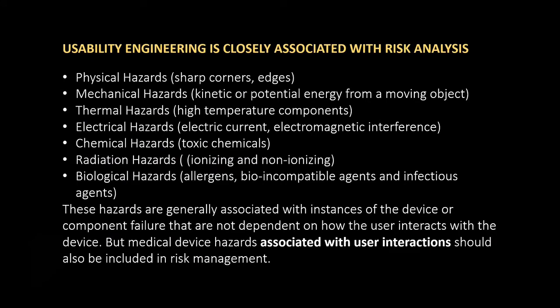So usability engineering is closely associated with risk analysis. As we talked about at the beginning, it's becoming an extremely important part of the development of medical devices. In our normal risk analysis, we're used to analysing all sorts of hazards: physical, mechanical, thermal, electrical, chemical, radiation, and biological. Now these hazards are generally associated with instances of the device failing. But medical device hazards associated with user interactions should also be included and are now extremely important.